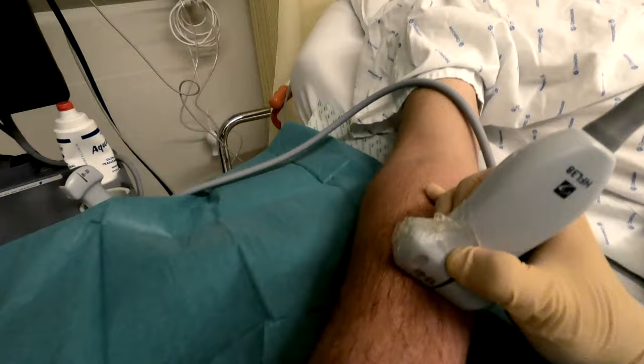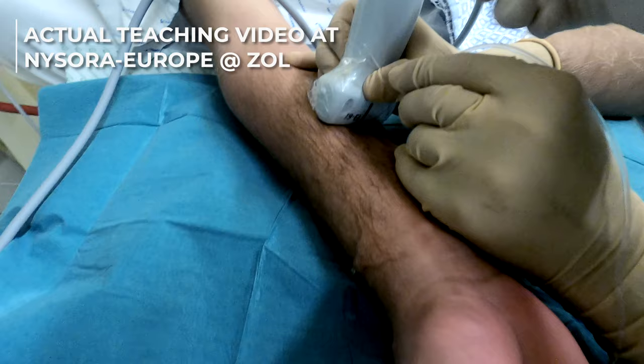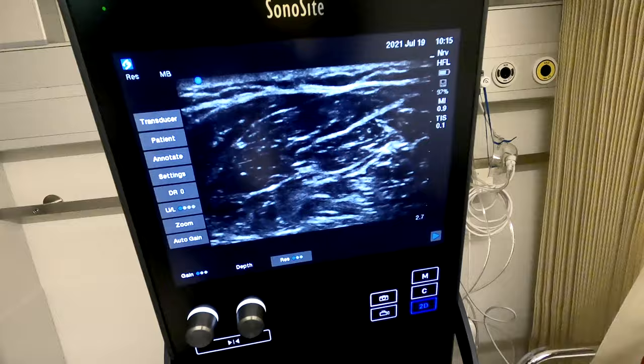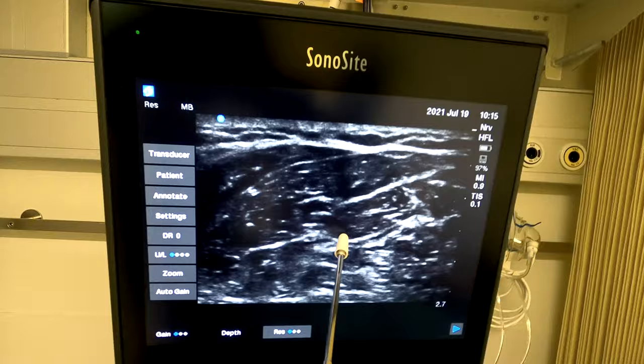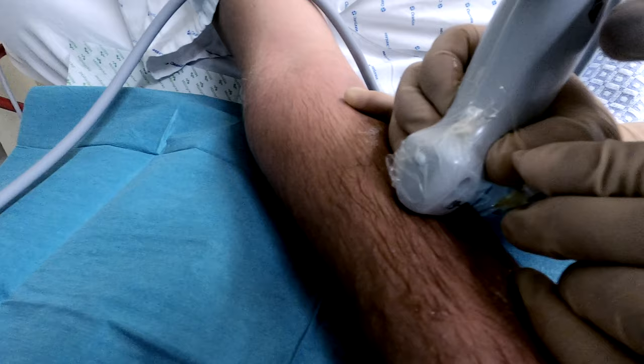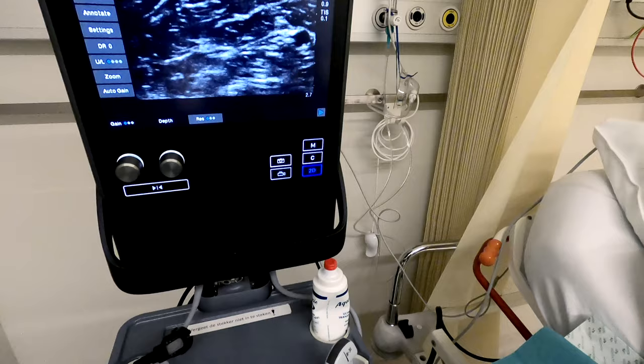We are going to use an out-of-plane technique here, placing the needle at a steep angle. We advance the needle until we see the needle tip. Here we need to use what we call a 'creep-up' technique: when the needle has passed the ultrasound beam, we move the transducer slightly higher so we can see the needle again. Now we can see the needle tip and need to avoid the median nerve by going slightly more medial.